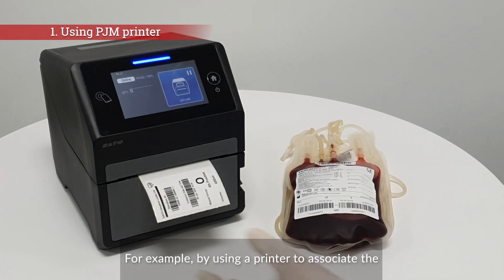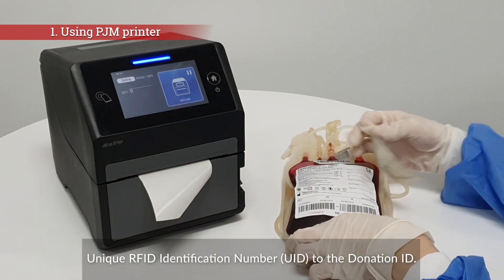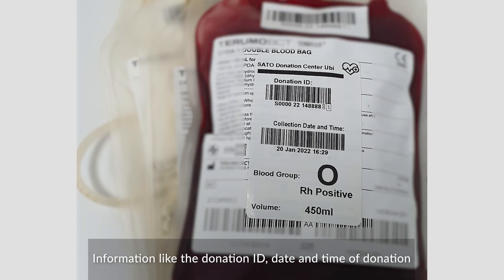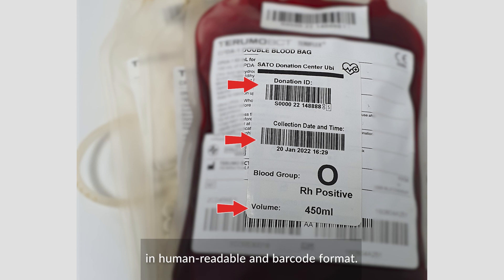For example, by using a printer to associate the unique RFID identification number to the donation ID. Information like the donation ID, date and time of donation, and the bag volume can be simultaneously encoded to and printed on the tag in human-readable and barcode format.